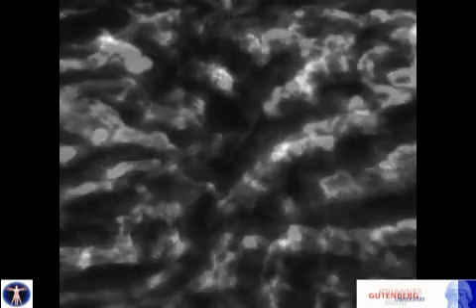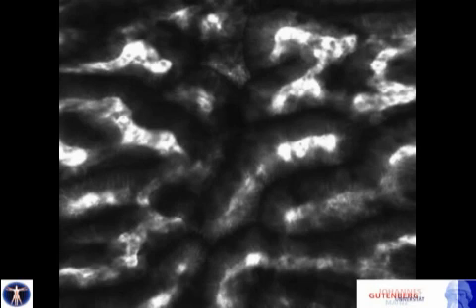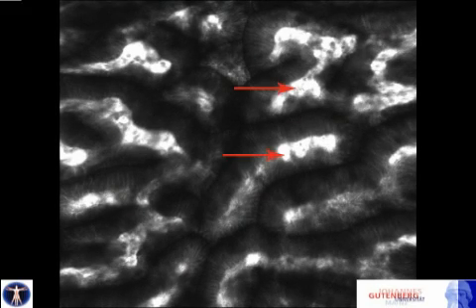The fine capillary network in the antrum is readily visible due to the bright bands characterizing single capillaries. Dark spots within the capillaries represent red blood cells.